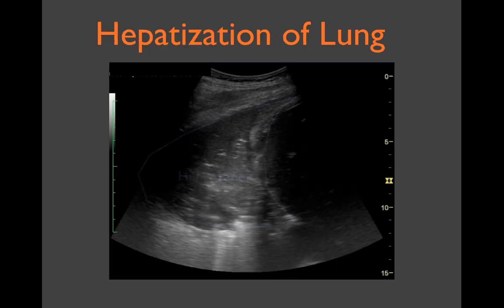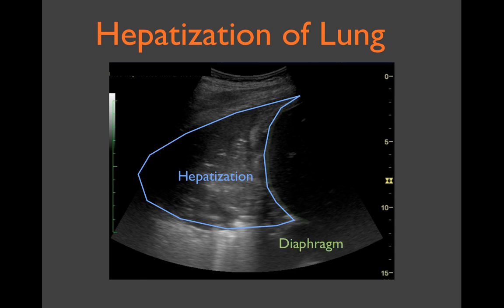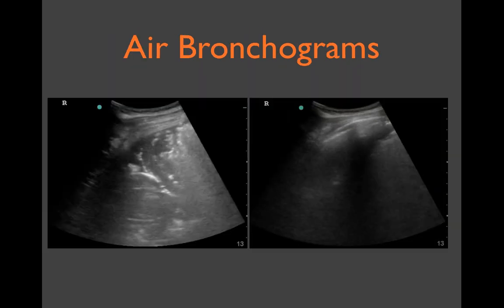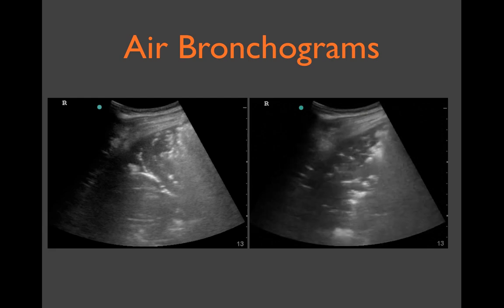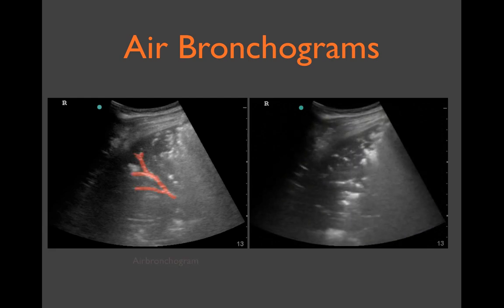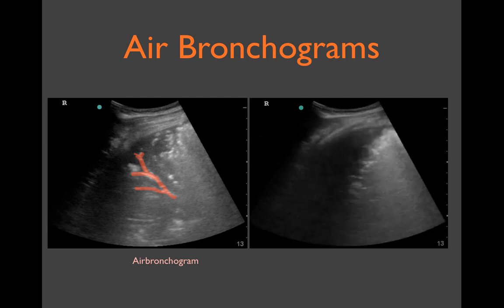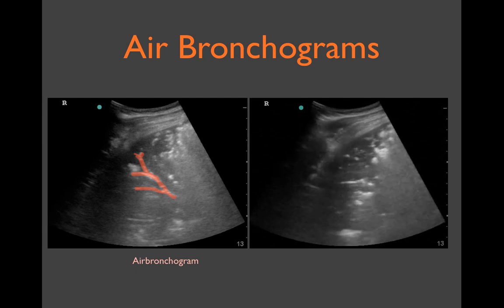What you see in the study of pneumonia is the deaerated lung parenchyma, which takes on an appearance similar to liver. This is sometimes described as hepatization. Here we see a large consolidation in the right lung base abutting the diaphragm. We also see numerous hyperechoic punctate specks and branching lines within the consolidation.